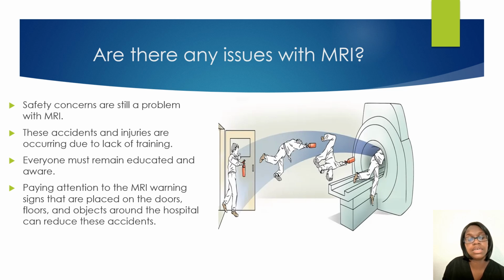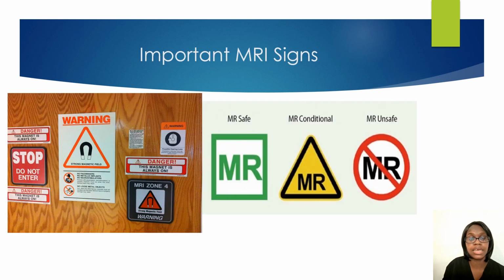A lot of times it could be due to lack of training and lack of education. So we have to make sure that everyone has the proper training and is educated. If you are an MRI tech or an MRI student, or maybe you're just a nurse who has to come down with a patient to the MRI scan, or maybe you're just a family member who came across this video to know more about MRIs, get familiar with these important MRI signs. It will tell you stop, do not enter.